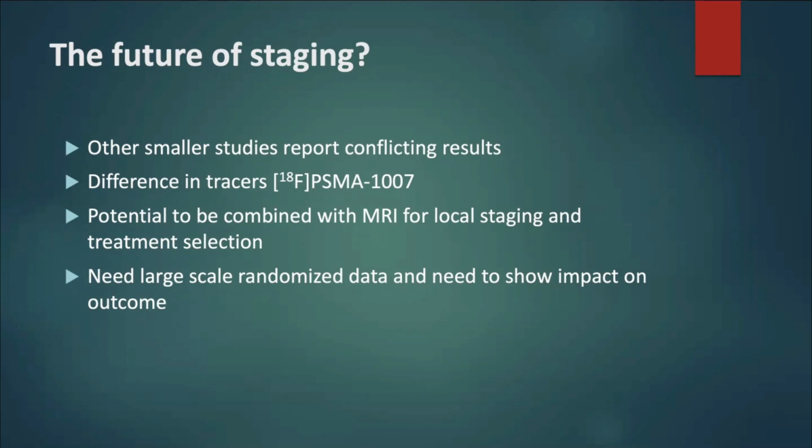PSMA PET is becoming increasingly common, particularly in Australia. In my experience, it's increasingly done in the UK. And certainly all patients in the UK would have an MRI pre-biopsy. So I can envisage this becoming a standard of care in the future. Now, that being said, there are conflicting results. As I mentioned, there's real difficulty in how these are reported, even down to hospital variability.